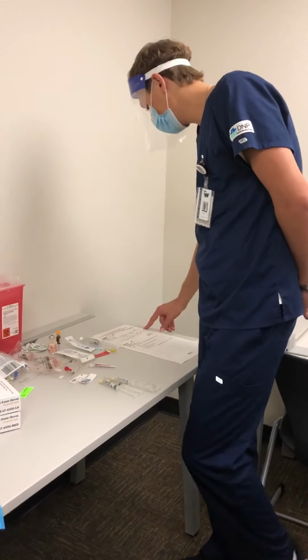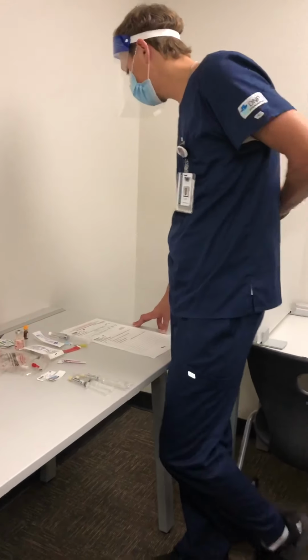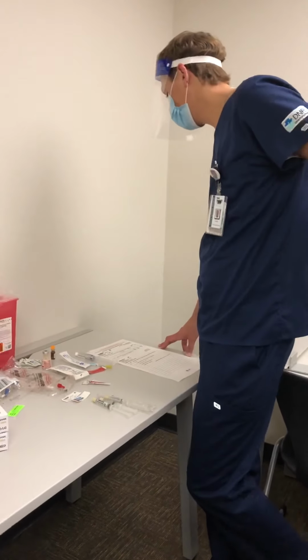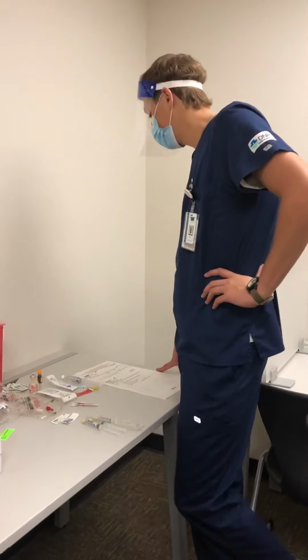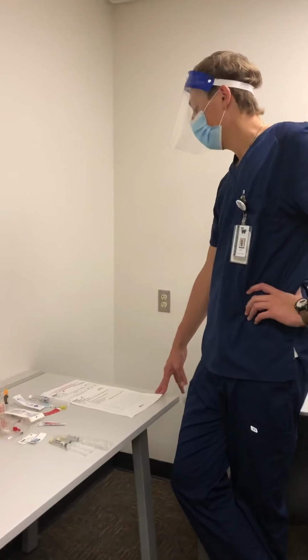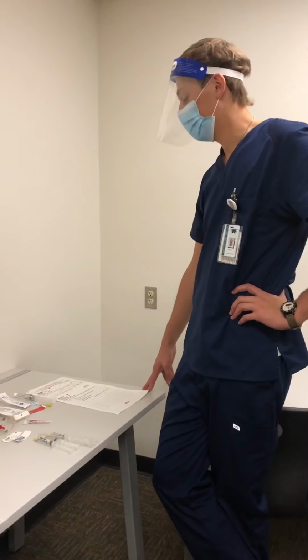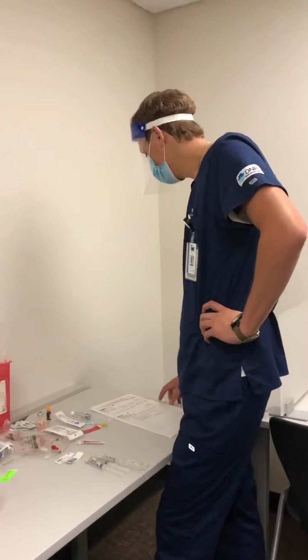I have here an order for 0.9% NS IV with 20 milliequivalents of potassium chloride at 125 mL per hour. That matches both of our healthcare provider orders. When I was reviewing Shirley's labs earlier today, I saw that her potassium was at 3, which is a little low, so that medication checks out. We should be getting that.